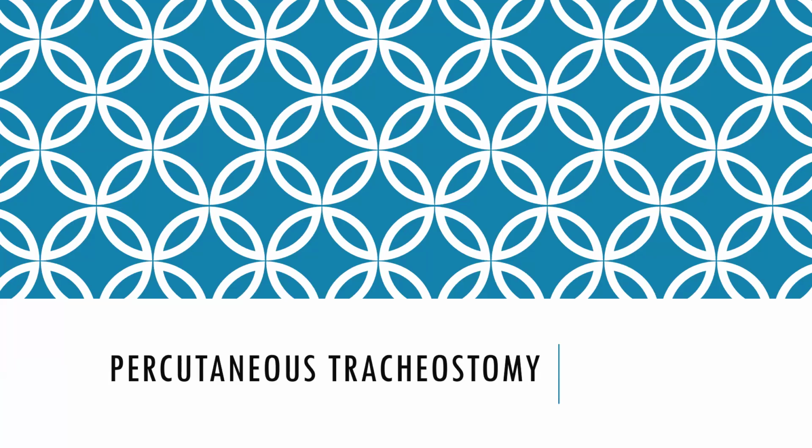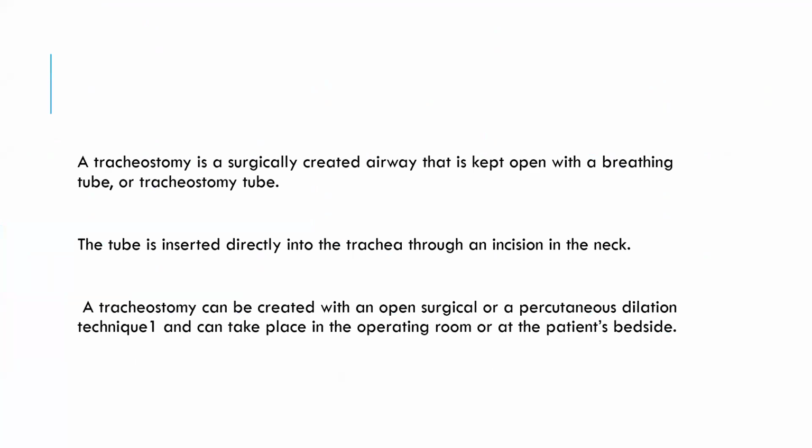Hello, everybody. Today's topic of discussion is percutaneous tracheostomy. Tracheostomy is the surgically created airway that is kept open with a breathing tube or tracheostomy tube. The tube is inserted directly into the trachea through an incision in the neck.